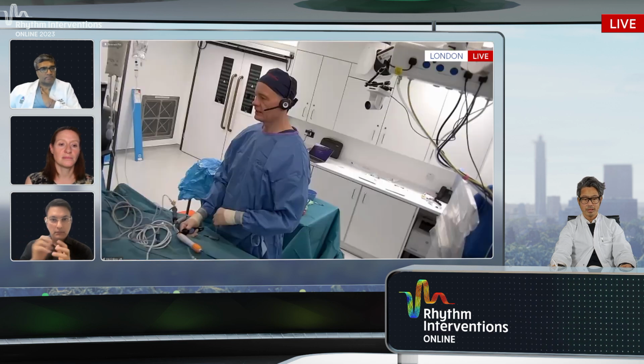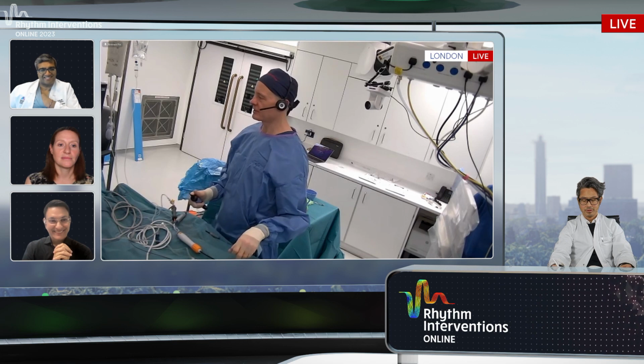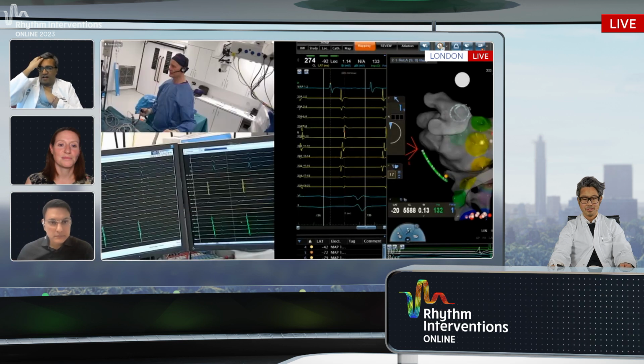So Claire has asked, so I will obey. I have already done it, but here's the left upper. I hope you can see the signals on the BARD. Yellow is clear.